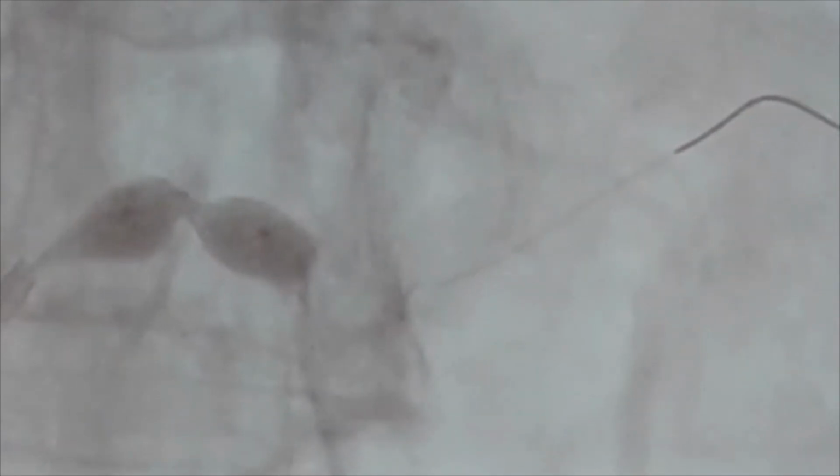They did direct stenting with a 6 millimeter stent. Stent balloon pressure taken up to 16 atm, that was the rated burst pressure, but they did not go beyond this to avoid stent edge dissection. This is something that we need to be careful with.